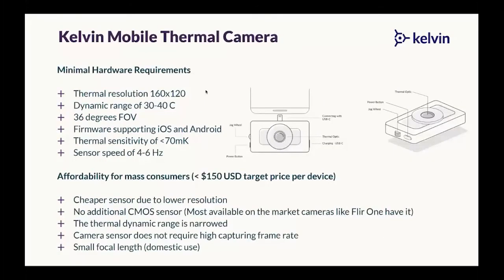I won't spend too much time on the technical part for the camera, but I just want to mention that our aim is to decrease the price of this to under 130 euro. I'm exploring opportunities to do this with several manufacturers of thermal cameras worldwide, even considering developing our own, so this can be more affordable and give more control of what kind of thermal signal we can read and how precise it is.